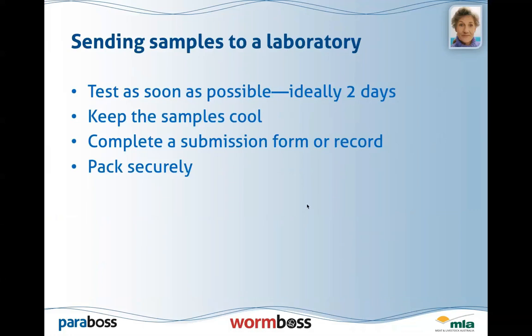So if you're in a warmer area or at a warmer time of the year, you can refrigerate your sample if you're not intending to culture it. Otherwise, if it's hot, just simply place those samples in a little esky with an ice brick till you're ready to take them or send them to the lab, just so they're not refrigerator cold.